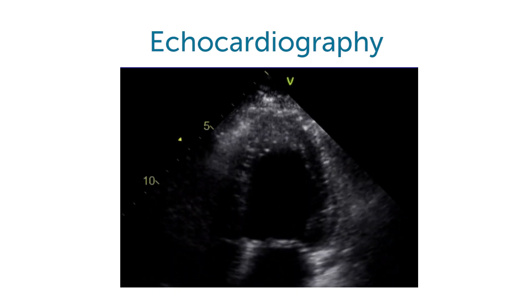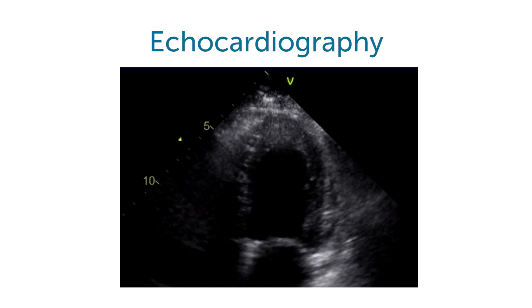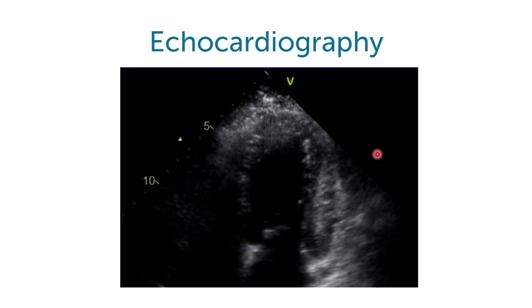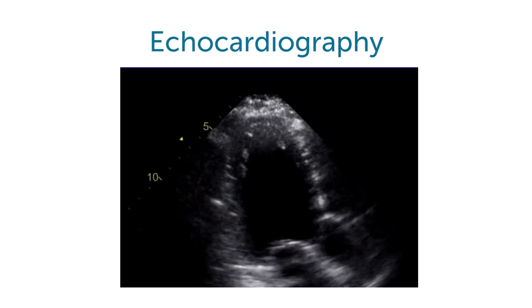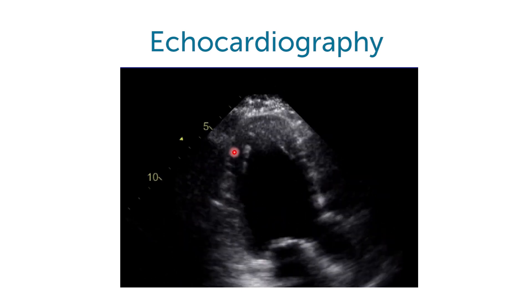But when you looked at the echo, you really wondered if this was a normal heart or not. Obviously there's something very strange happening here in the lateral wall. This wall does not move normally, and when you look at the three-chamber view, very similar things can be observed in the posterolateral wall. Also here we see a sort of abnormal motion.